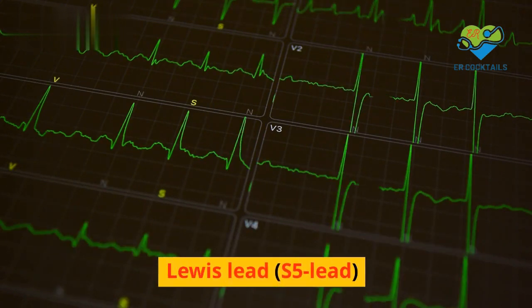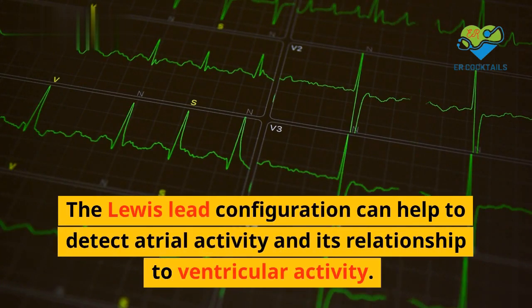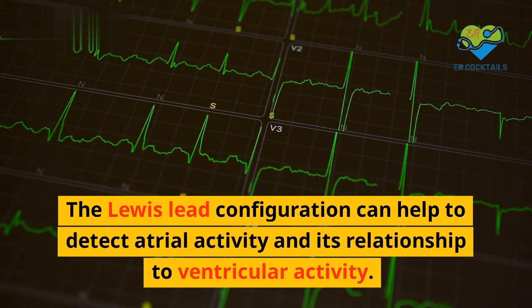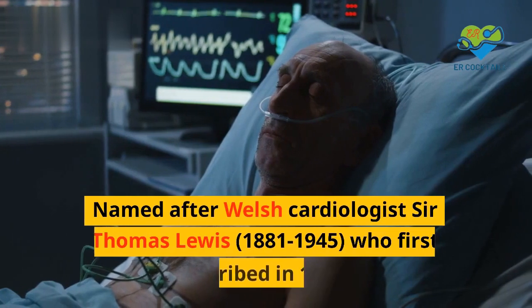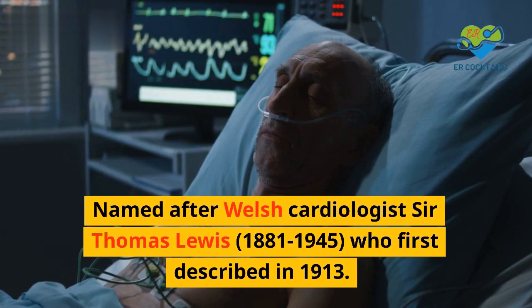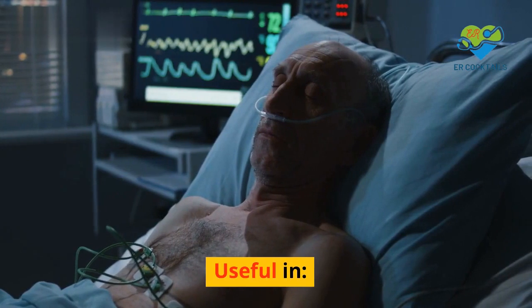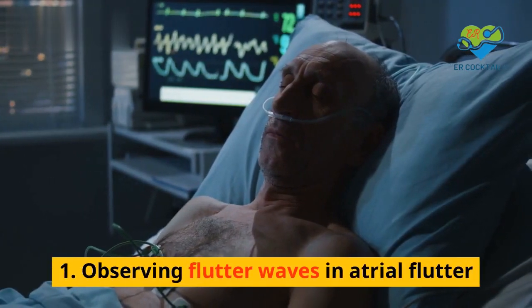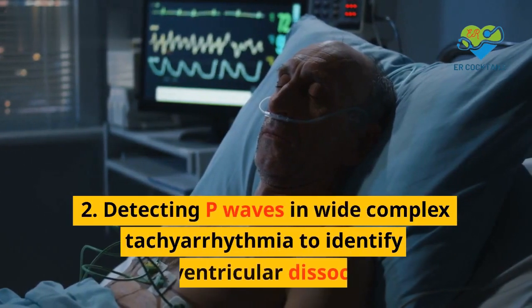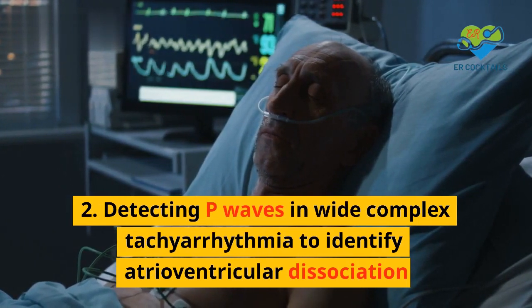Lewis lead, S5 lead. The Lewis lead configuration can help to detect atrial activity and its relationship to ventricular activity. Named after Welsh cardiologist Sir Thomas Lewis, 1881 to 1945, who first described it in 1913. Useful in: 1. Observing flutter waves in atrial flutter. 2. Detecting P waves in wide complex tachyarrhythmia to identify atrioventricular dissociation.